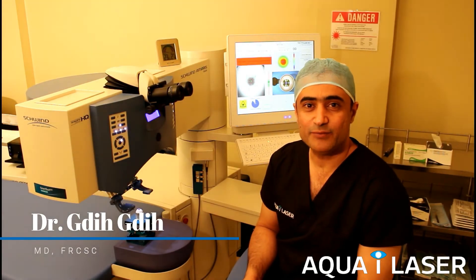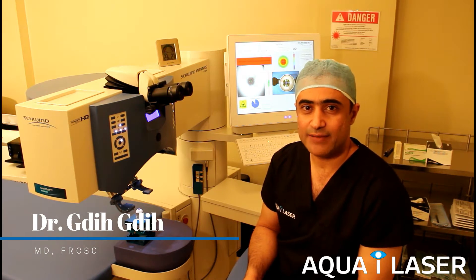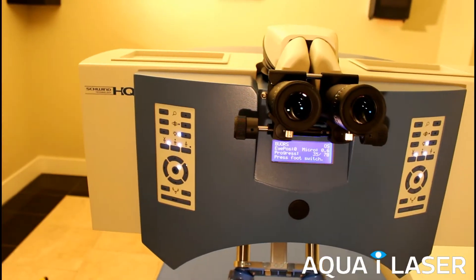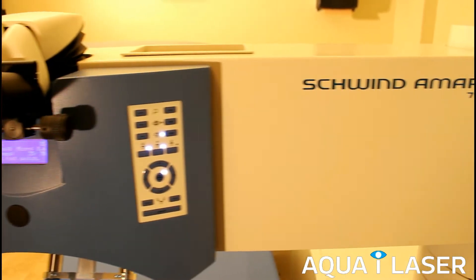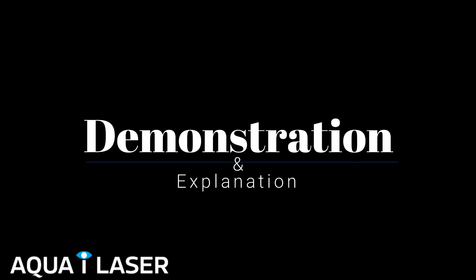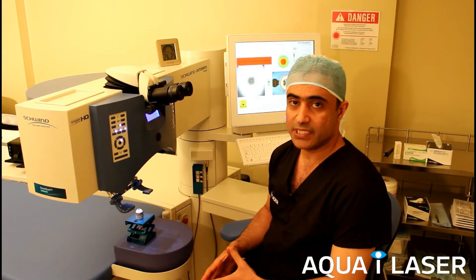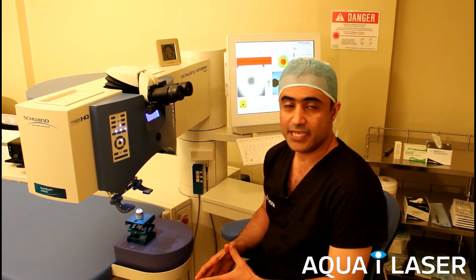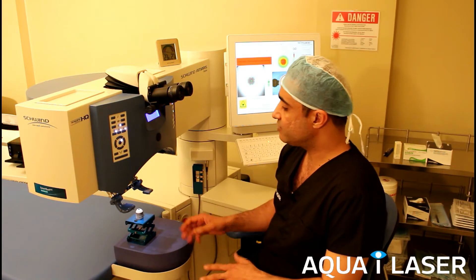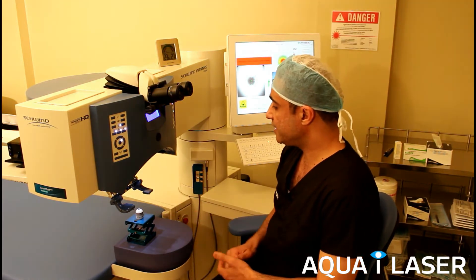Hi, I'm Dr. Gide from Aqua Eye Laser, and today I'm going to explain how the Schwind Smart Surface Touchless Laser Vision Correction Procedure is done with the Smart Trans Epithelial PRK Technology. When we do the laser treatment, nothing comes in contact with the eye and everything is done from a distance. I'm just going to show a demonstration here with an artificial eye.